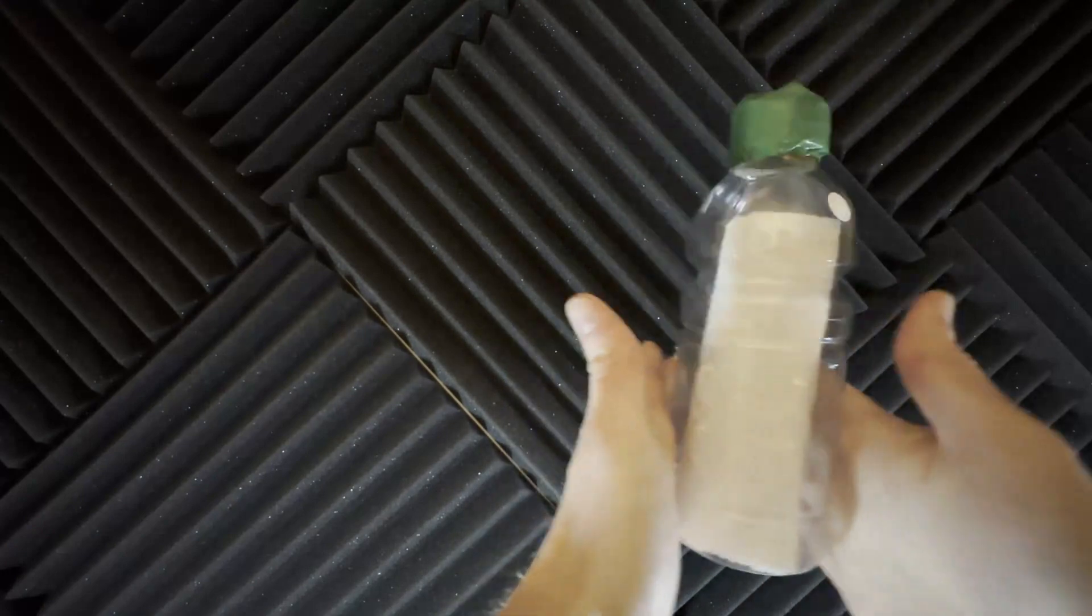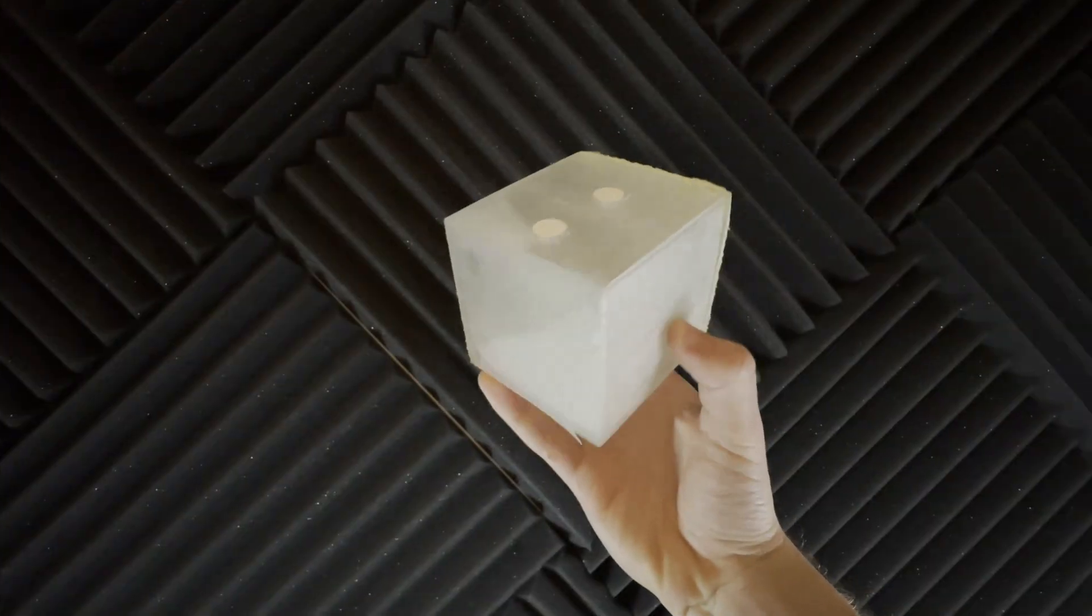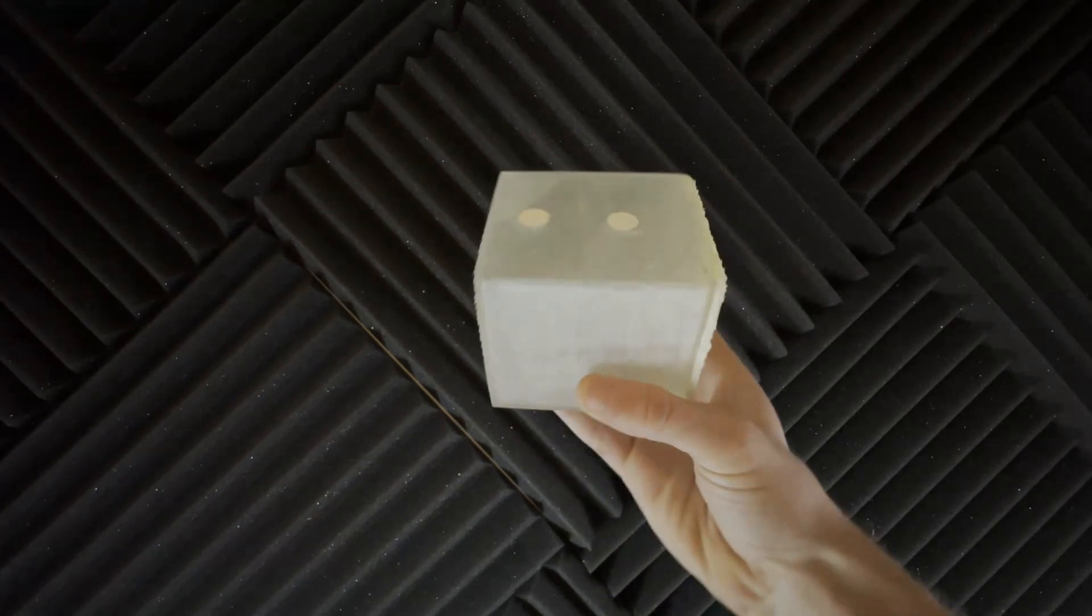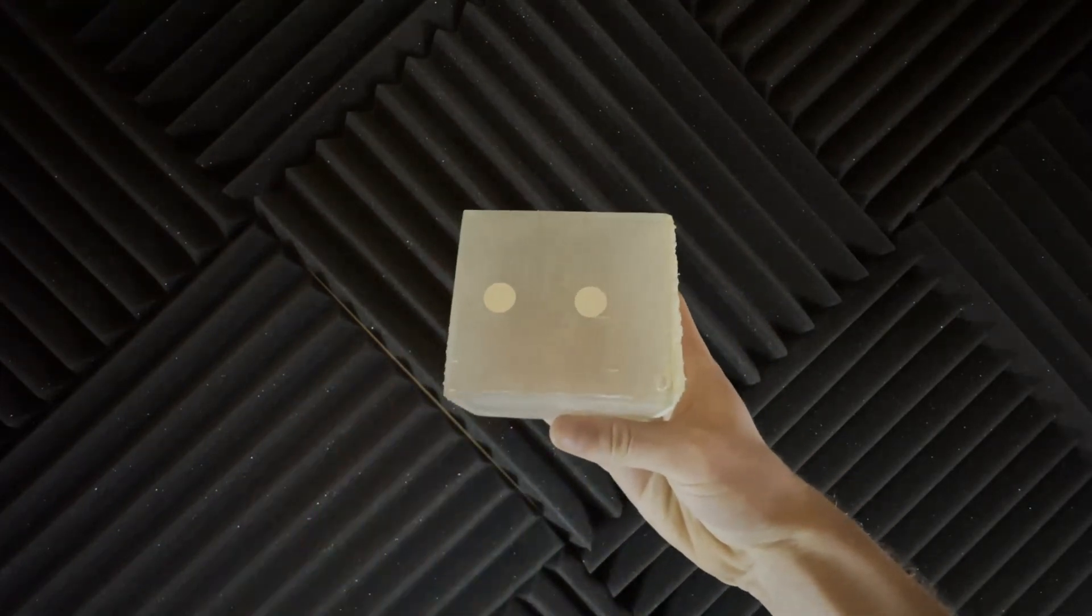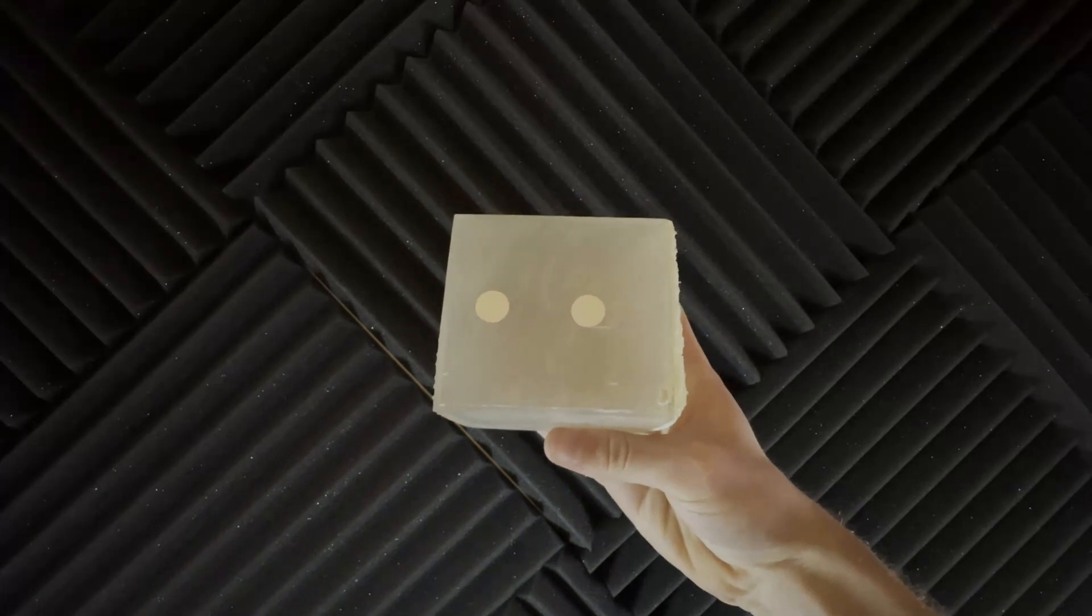Satisfied with our results, we moved on to a beta prototype. This is our beta prototype. It's a hollow cube, 3D printed with resin, and has two holes covered with the material.